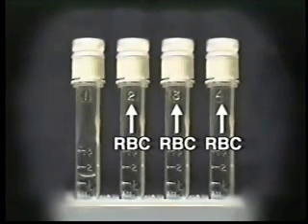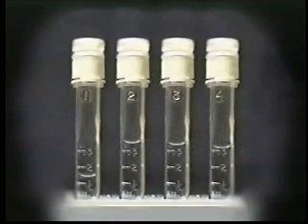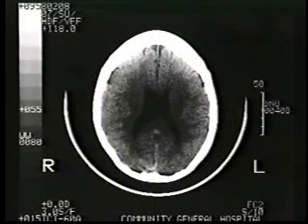Immediately centrifuge the CSF. It will be colorless in a traumatic tap, but xanthochromic if hemorrhage has occurred. If there are no other untested samples available, rerun what you have, or consider retapping. Included in the workup of suspected hemorrhage should be a good neurological exam and head CT without contrast. If any of these tests indicate a bleed, a neurosurgical consultation should be obtained.